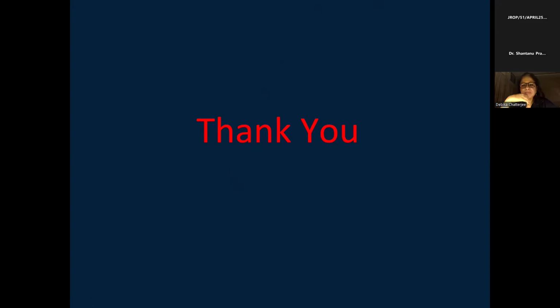Thank you, sir. Thank you, ma'am, for your excellent presentation. You mentioned that while evaluating diastolic dysfunction, we grade them grade 1, grade 2 and grade 3, and we use E by E prime of more than 14 or a TR velocity of more than 2.8 and a LA volume index of more than 34. Ma'am, please explain when we use IVRT or propagation velocity in diastolic dysfunction? Do we use it routinely, or is it just corroborative evidence?